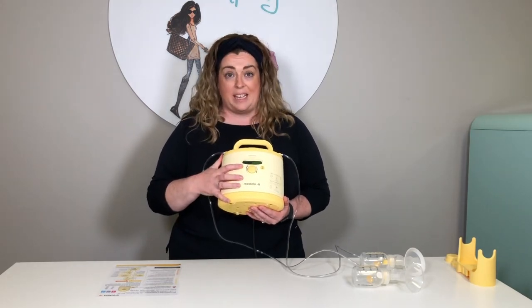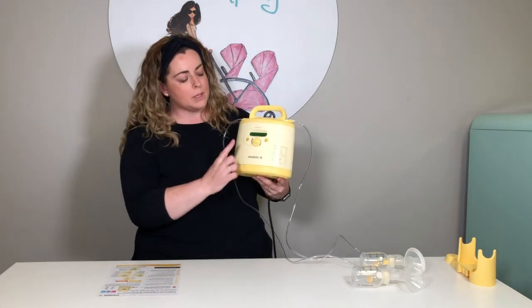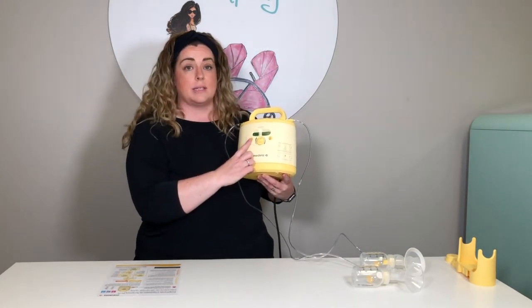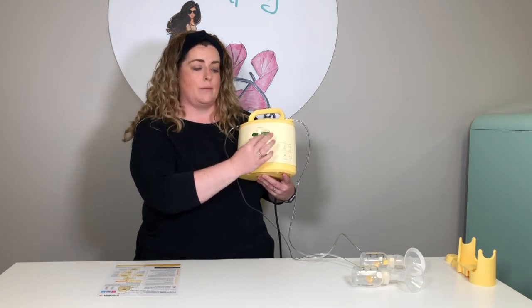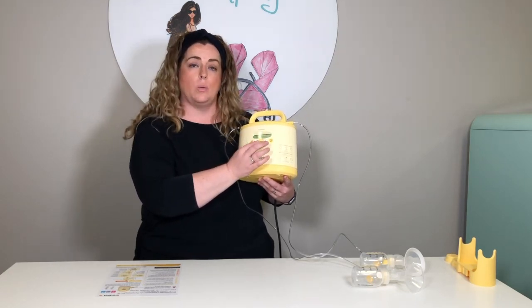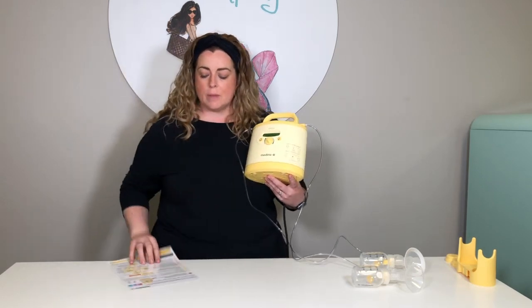So I'm going to turn it off again just because the settings will change when you turn it back on. So just to recap, this is the power button. It's a very simple push. This is the suction button. Again, very easy to turn and adjust where you want to. And this is what we call the initiate button.